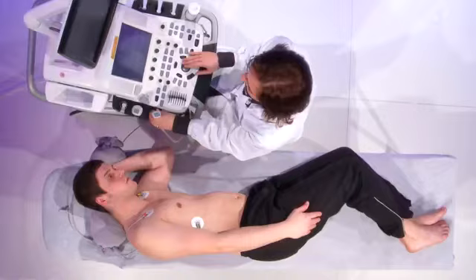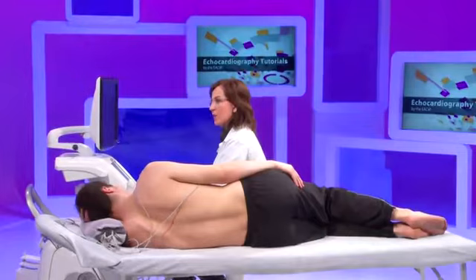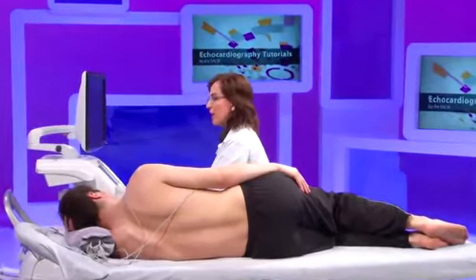Here we have a 17-year-old patient with tetralogy of Fallot. He underwent correction of tetralogy of Fallot very early, at the age of 8 months, by a transatrial approach, and also underwent patch insertion for enlarging the right ventricular outflow tract. As usually happens, these patients at long term develop pulmonary regurgitation, and this is a follow-up examination in order to assess the severity of the pulmonary regurgitation and the consequences on the right heart chambers.